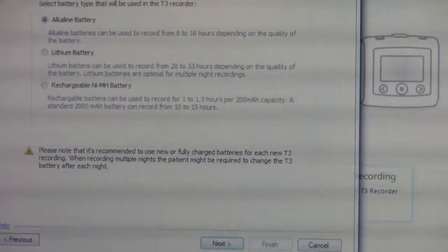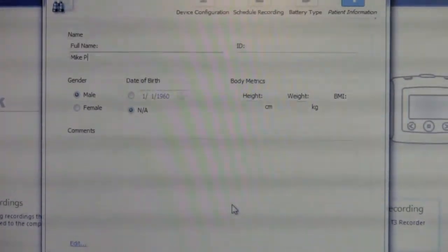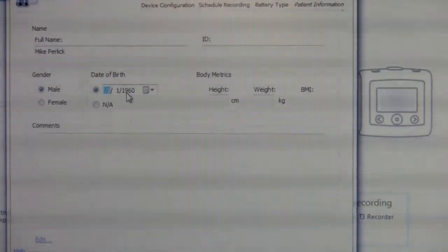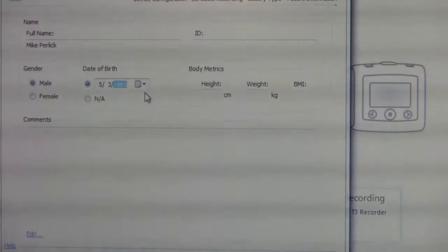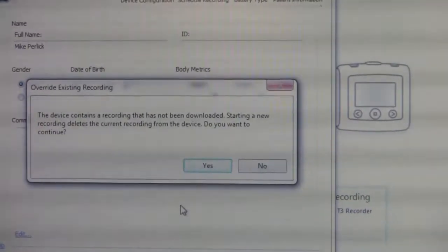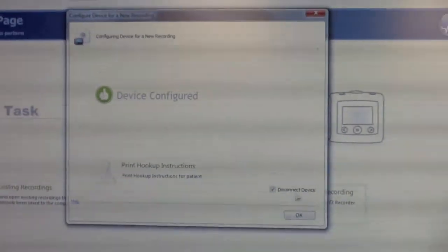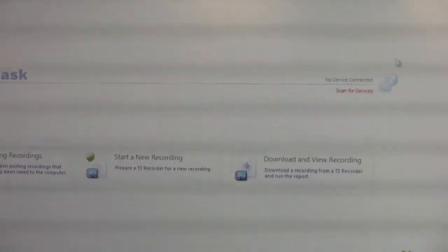We're going to use alkaline batteries in the monitor. Here we enter the patient's name — today's patient is Mike Perlick. He is male, and his birth date is May 3rd, 1965. If you have other patient information you can add it; the more information the better for the physician reading the report, but it's not a requirement. We're going to say yes, we want to start a new recording, and it is now configuring our device. With the check mark it will automatically disconnect the device from the software, and as I click OK you will see that the device is no longer connected.